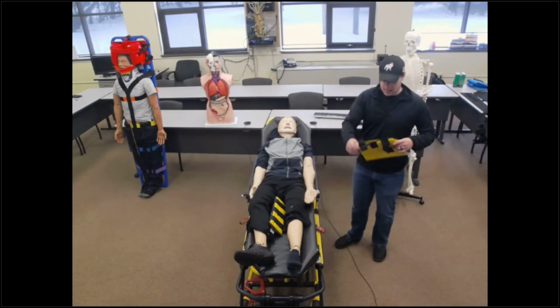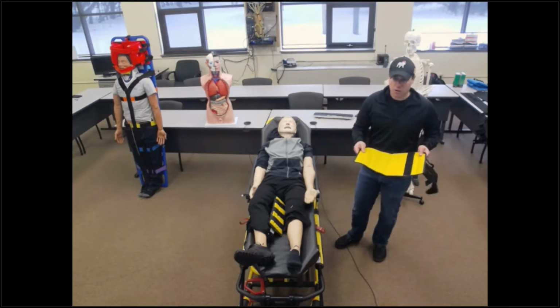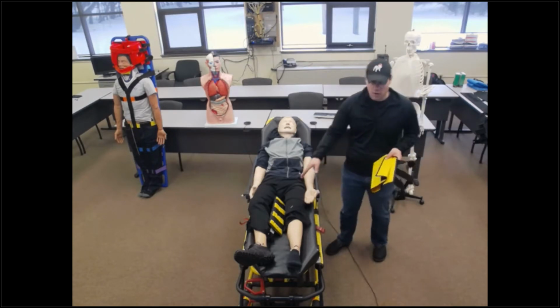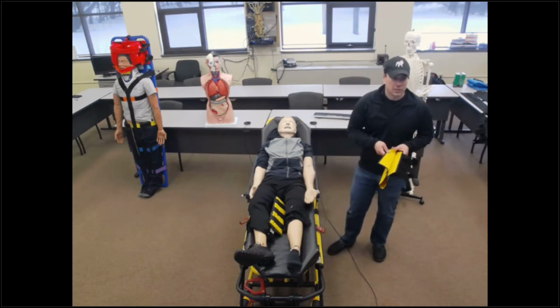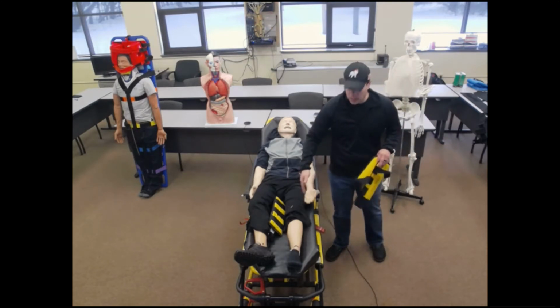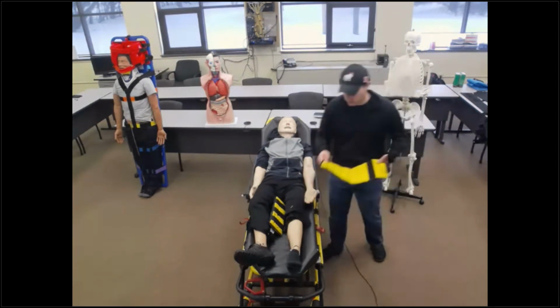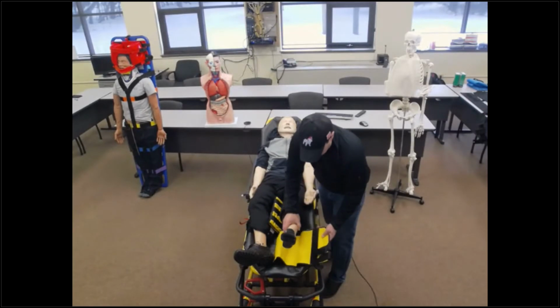As mentioned in the introduction to splints, they have a wide variety of different sizes of your prefabricated splints. So this one is specific to a lower leg injury, specifically to the ankle. The other one is specific to a hand and wrist. I have larger ones in the event that the patient's complaining of pain up and down their entire leg, where I can go ahead and stabilize that specific.